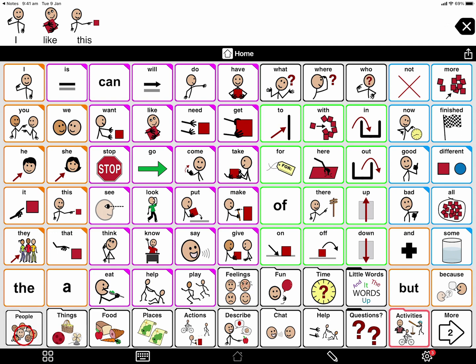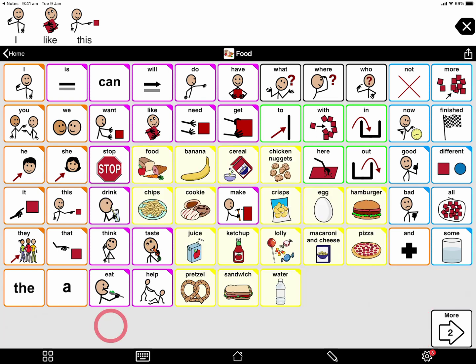These buttons along the bottom with the little tab on them are actually called folders. When I tap on these, it takes me to another page filled with even more words. Like here is my food page — this has some good food words, but we'll definitely have to learn how to add some of my own favorite foods here.